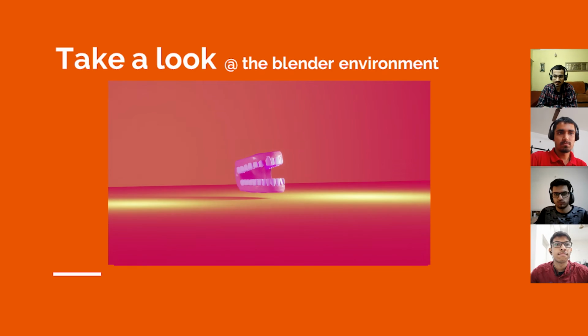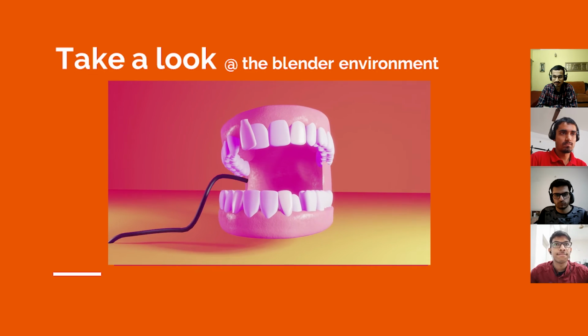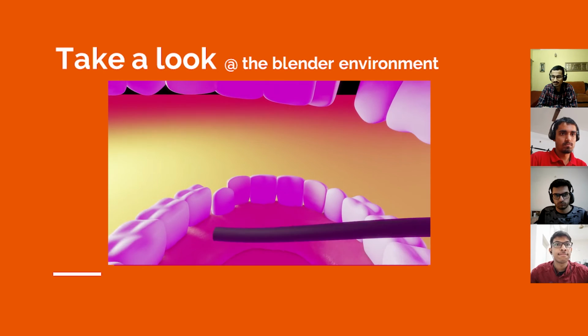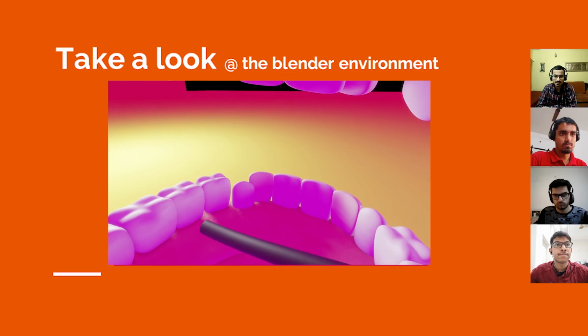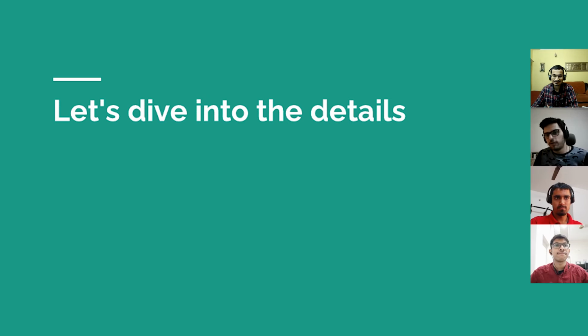To train our imaging and landmark system, we have put together a Blender environment which can render accurate images with respect to the lighting and field of view conditions as observed from a mouth cam. Using the plugin Blender for Dental, we will simulate caries and cavities. Now let's dive deeper into the low-level details of our pipeline.